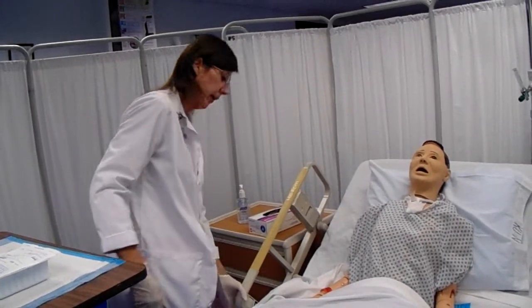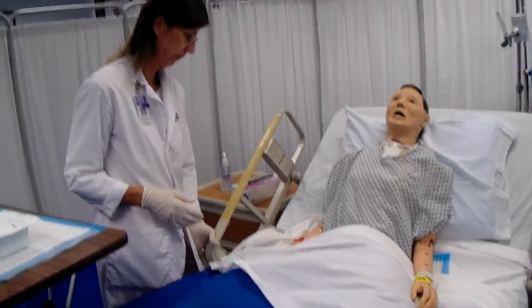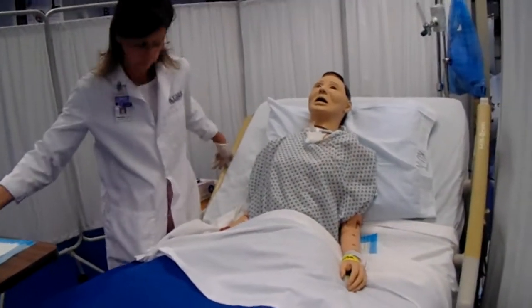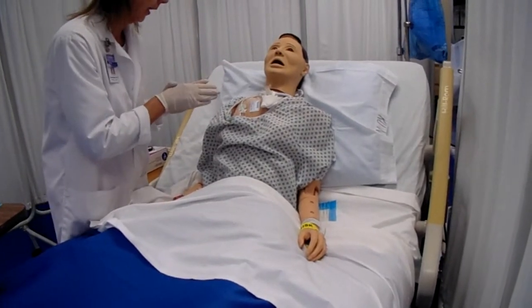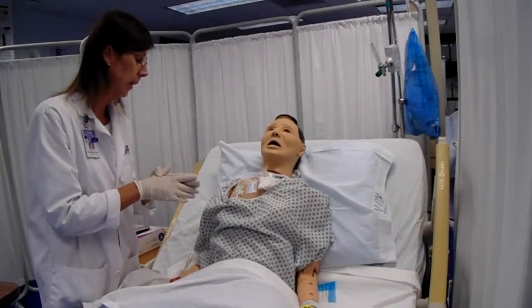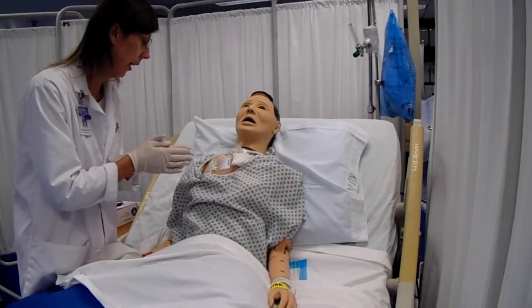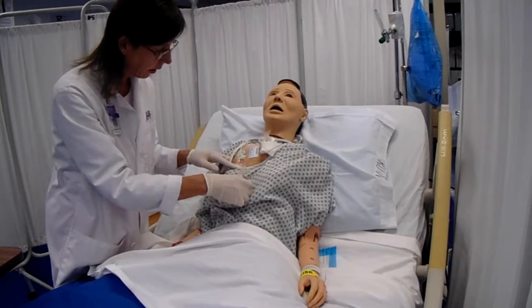Okay, I'm going to go ahead and raise the bed and inspect your central line and the dressing. This should not be painful in any way, Mrs. Cooper. Okay, I'm looking at the central line dressing, and I'm determining if it's time for us to change that. We'll change the dressing if it's visibly soiled, damaged in any way, or outdated, or per hospital protocol. I see that your dressing is outdated, and therefore I'm going to go ahead and change it. Okay, let's check the end of the tips to make sure that they're all clear and no signs of infection.